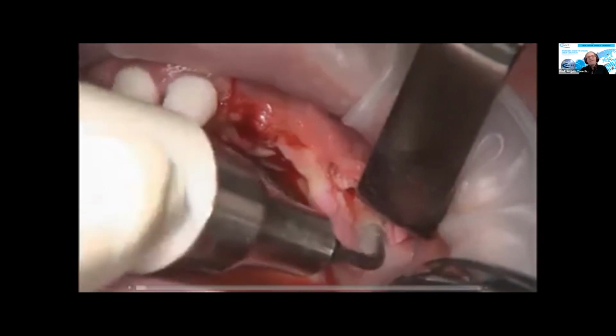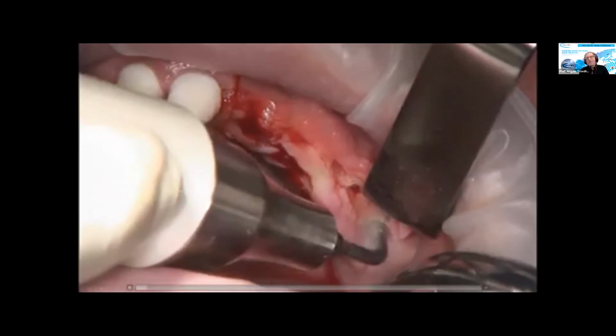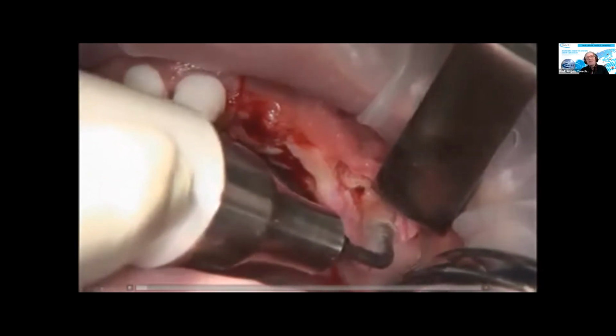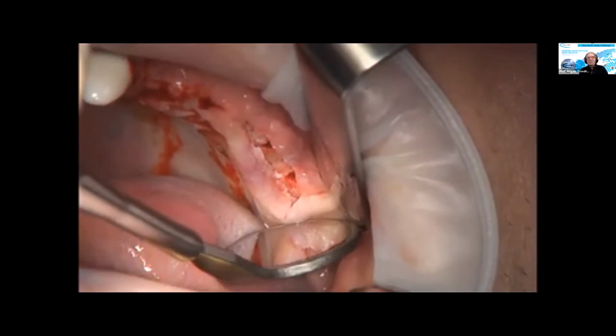So we started with a mesiodistal mucoperiosteal incision from the incisor area to the second molar area. And now we are already at the stage of preparation of the transcrestal approach.